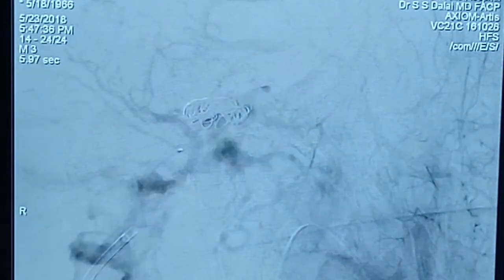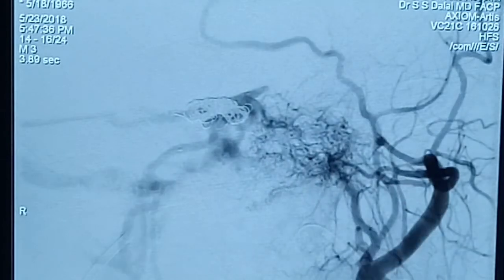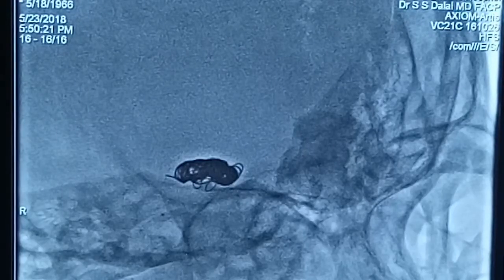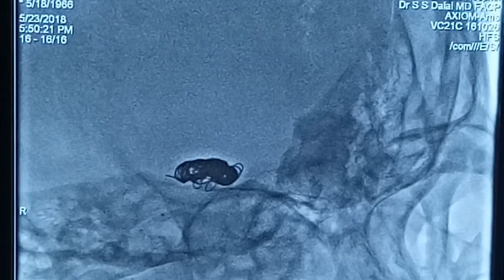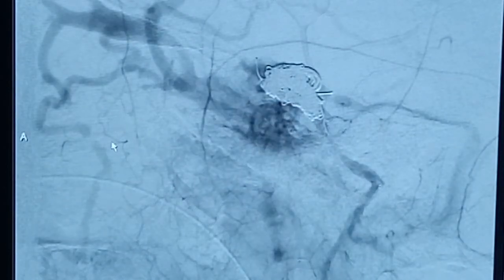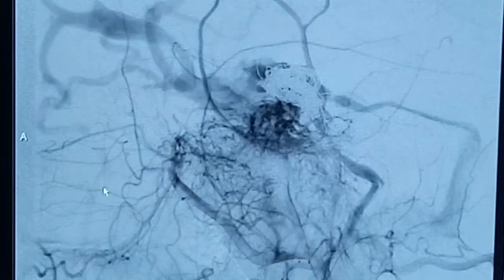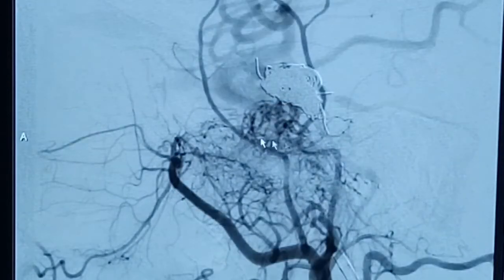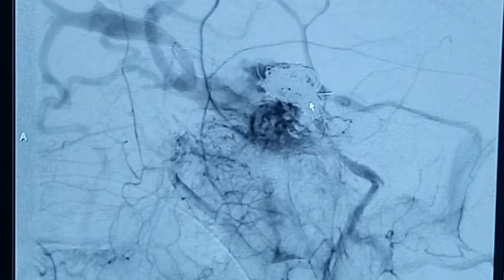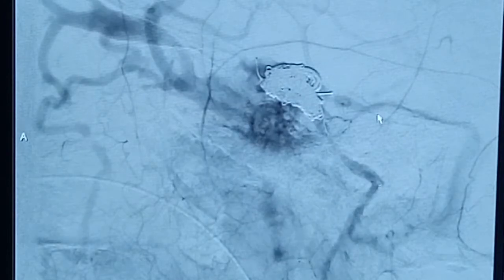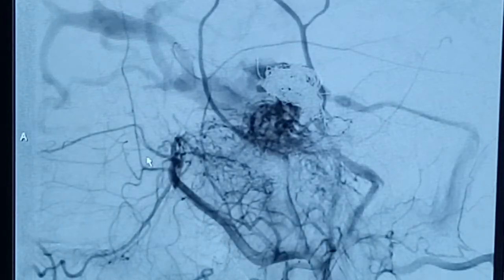The carotico-cavernous fistula is slowing with the coiling; we will progressively coil and monitor progress. We can still see multiple meningeal feeders continuing to fill even with a good amount of coil placed in the cavernous sinus. These feeders certainly need to be embolized, otherwise treatment will be incomplete. I would also like to address the foot of the superior ophthalmic vein, which is very dilated, so we will move on to liquid embolics.